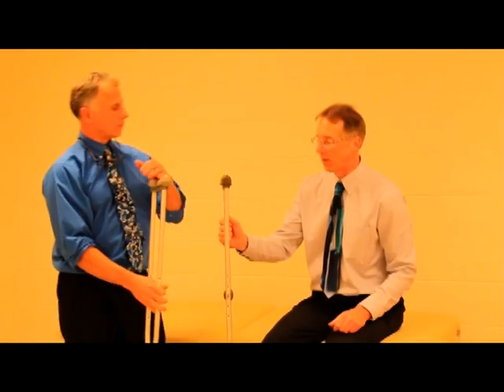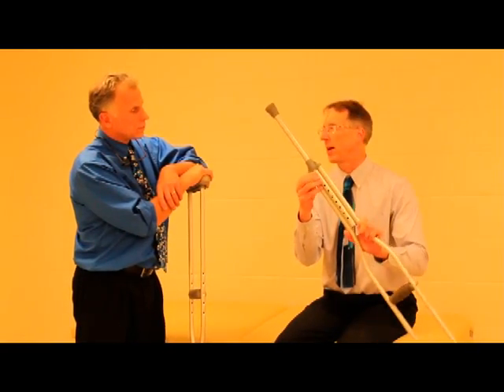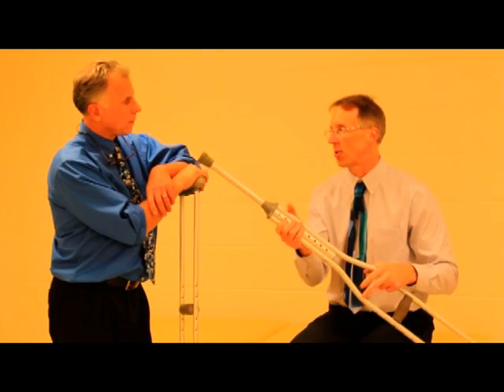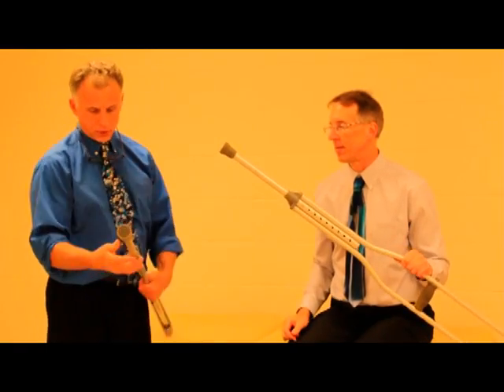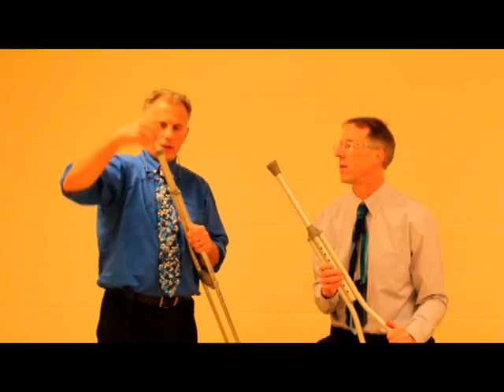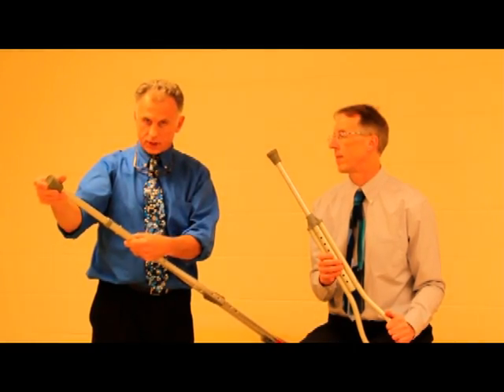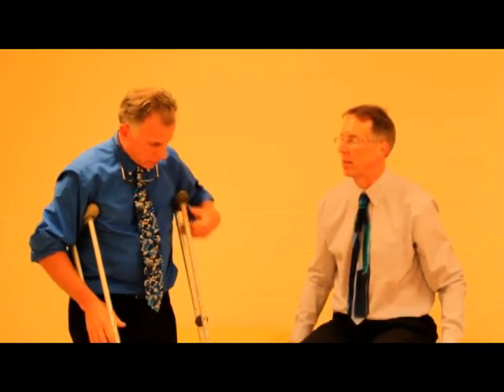So Brad, let's start off — with most of these crutches now they have a little push pin here, and there are actually some numbers along here. For example, this one goes all the way from five-one to five-nine. So it's a good starting point: if you're five-nine, go ahead and set it up at five-nine. You push these buttons in — it's a telescoping deal — and I always like to turn it just a little bit, then you can slide it up and down, but you've got to get those holes lined up so they click and the button pops out just like that.